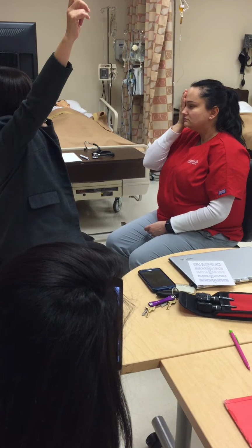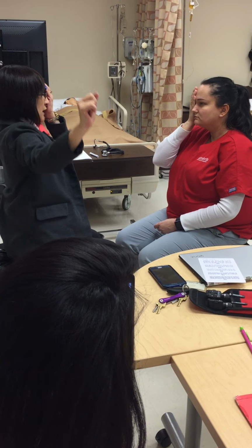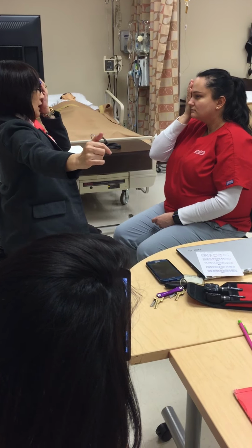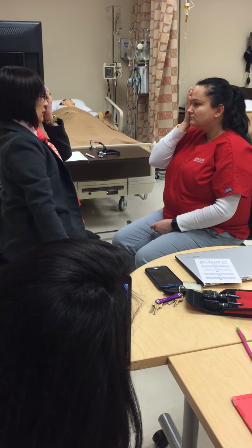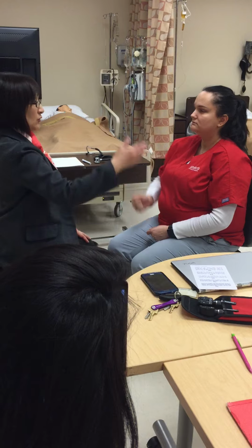So that's superior, that's 50. That is temporal, that's 90. That is nasal, 60. That is inferior, 70. Why do you cover your eye?